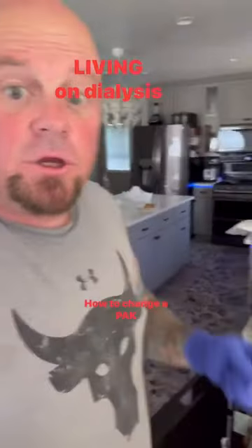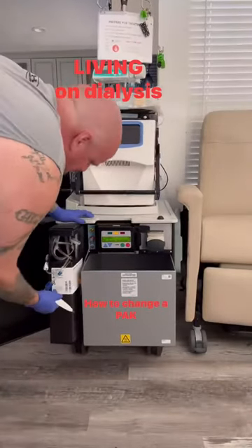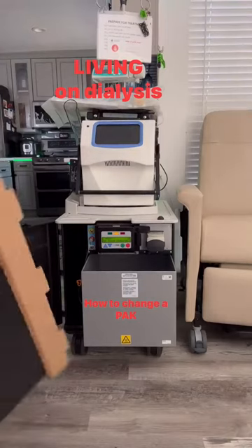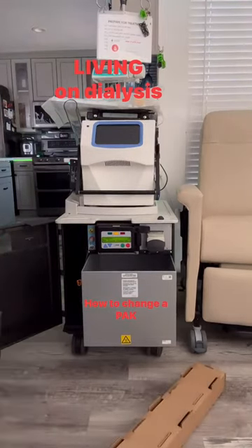All right, this is Michael. I'm going to show you how to change a pack real quick. Pop it off. Hold that out. Get the new one. Pop that container.